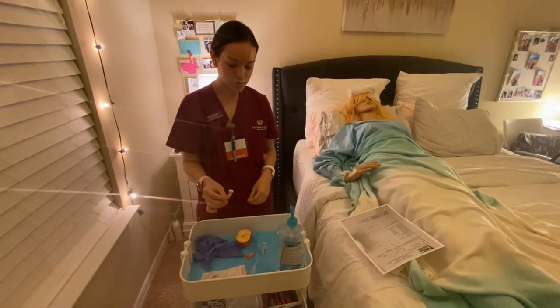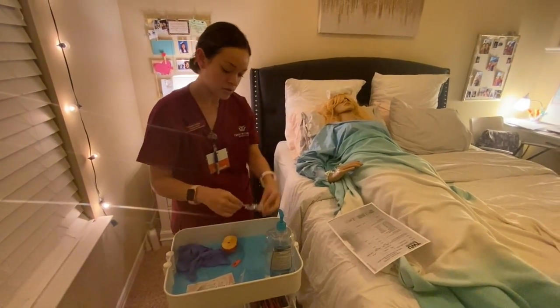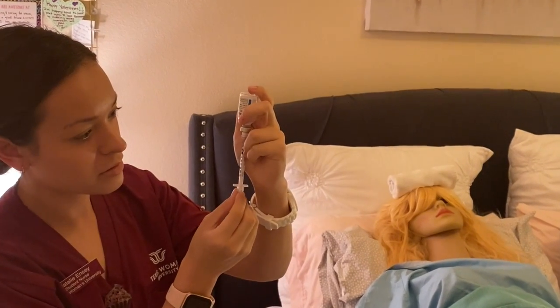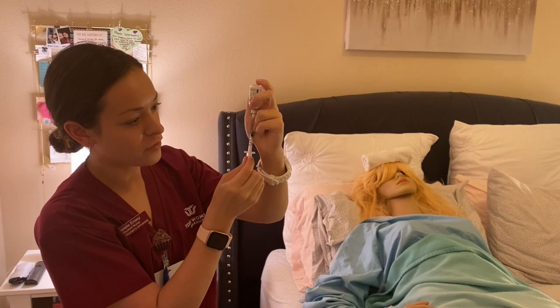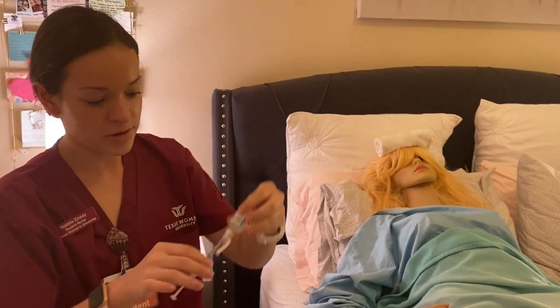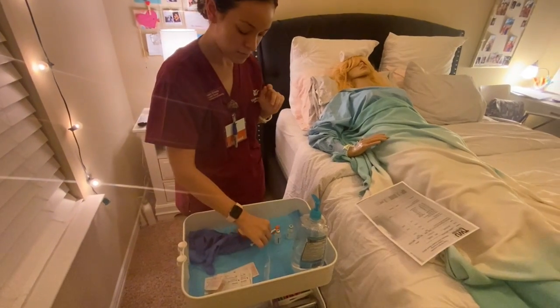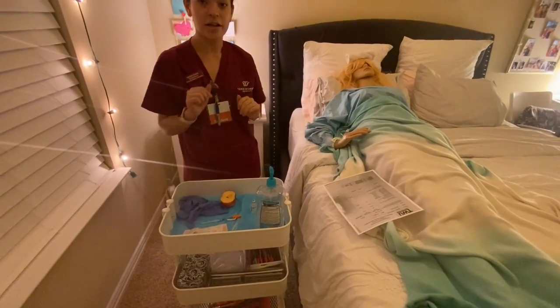And now I'm going to insert my syringe into the NPH. I'm going to turn it upside down, and I'm now going to pull for 30, making sure I don't get any air bubbles. And my total should be 34 units. Okay, so I have 34 units. And now I'm going to do the scooping action to put on the cap. I'm just going to cap it before I actually insert it.